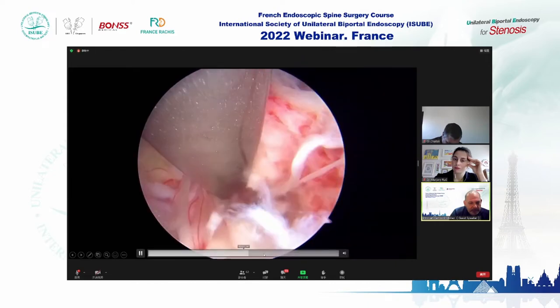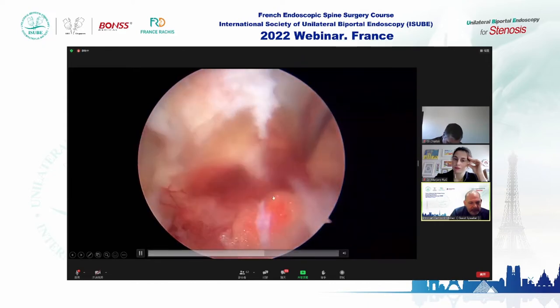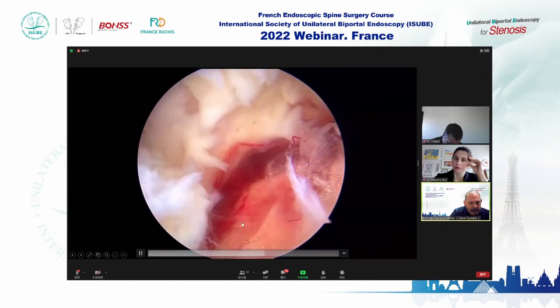We have removed the disk, and you can now see the nerve root and the dura are decompressed.